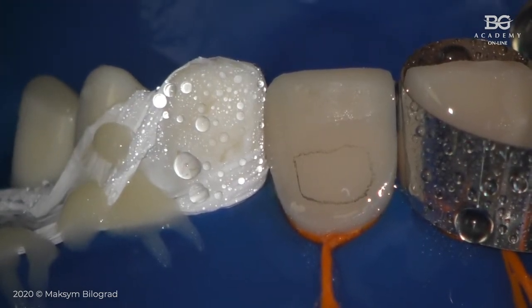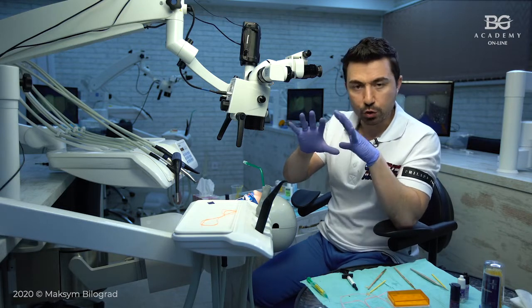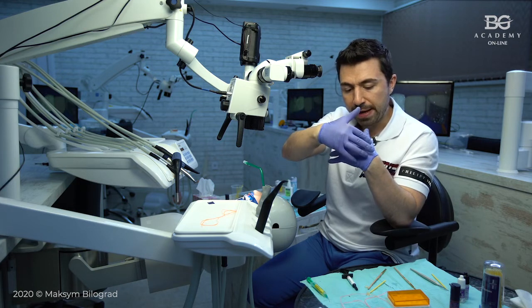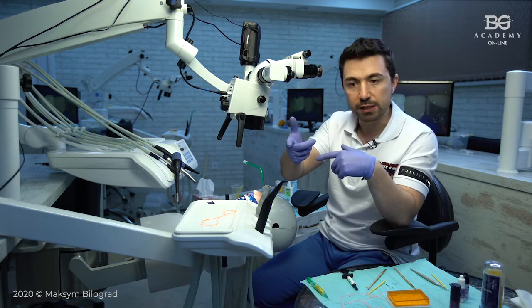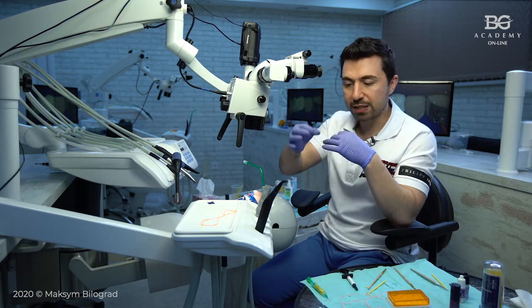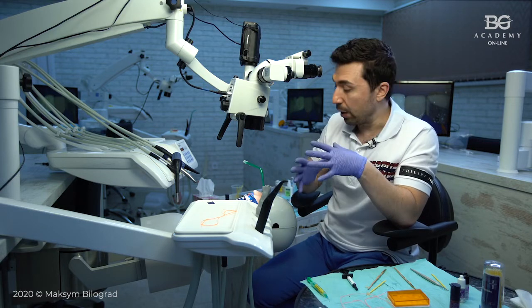What was important in case you are using total etch adhesive system? You have your etching gel on enamel for 20 seconds. Then you spread with brush your etching gel to dentin. Once all dentin is covered, you count for 5 seconds only and then you rinse. Literally, we are not etching dentin for 5 seconds. But once the first drop of the etching gel appears on the surface of dentin, the time starts to be counted, okay?